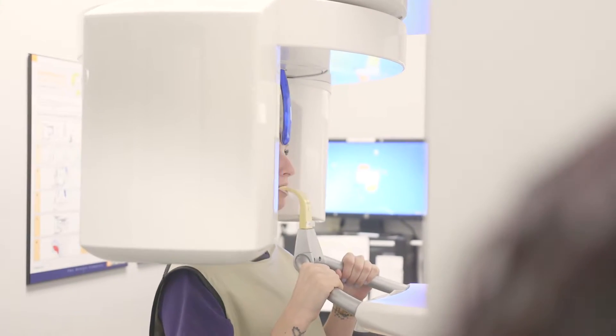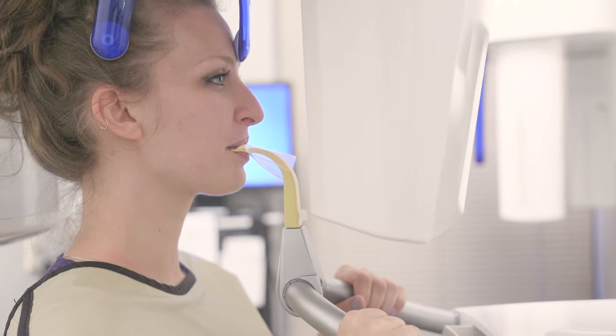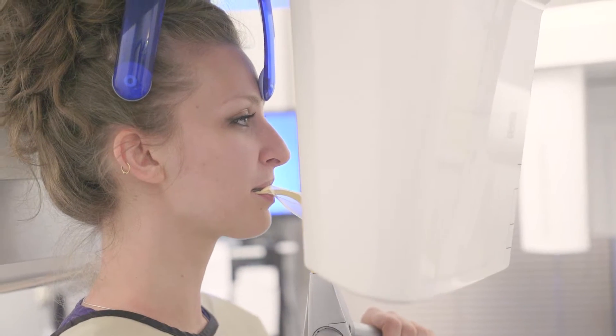The importance of the CT scan for us is it enables us to diagnose and see things in dentistry that we normally would not be able to diagnose and see on a conventional two-dimensional radiogram. Sometimes we can't diagnose something because we don't have the sufficient information that we need, and that's where the cone beam CT scan comes into play.